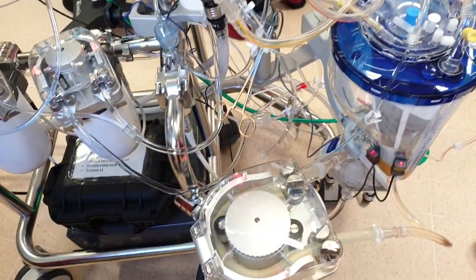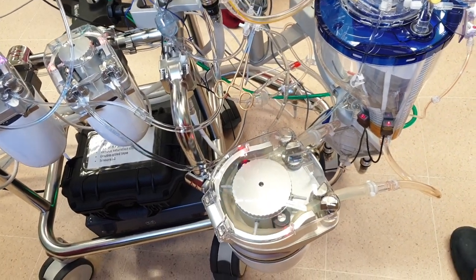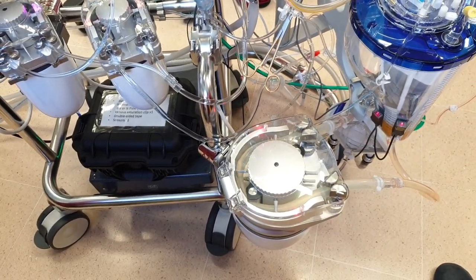Should go on. Same with that. Yes, so we're good with that. Check, yeah? Only the bubble detector you need to go back on. So the rest everything will come automatically.